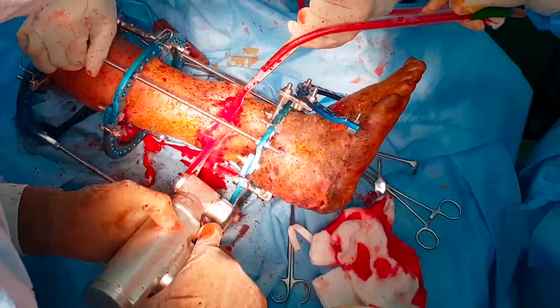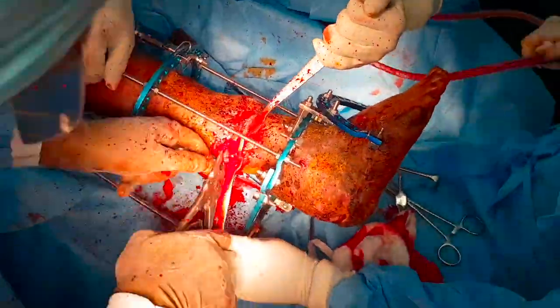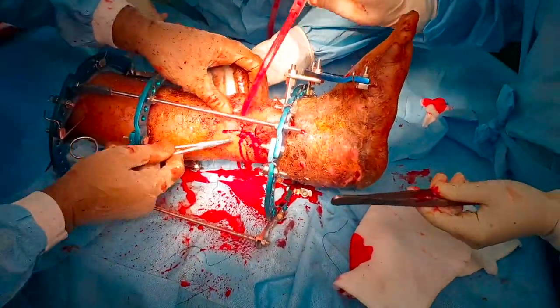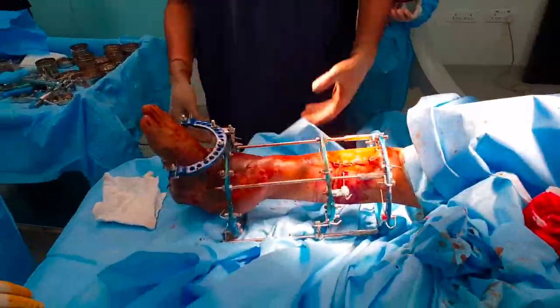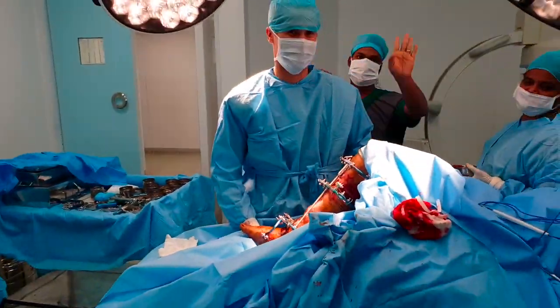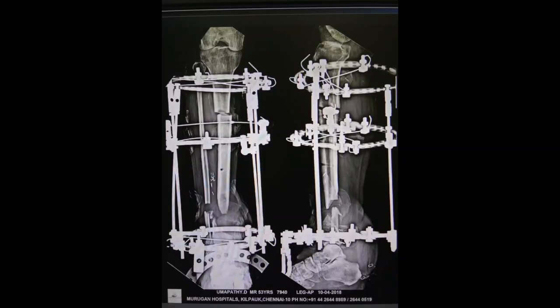For an above-ankle fibular osteotomy, the appropriate level is chosen and a one-centimeter bone is resected to ensure that the bone transport segment floats down without obstruction. The stability of the frame is tested and knee movements are permissible until the abutting of the rings.